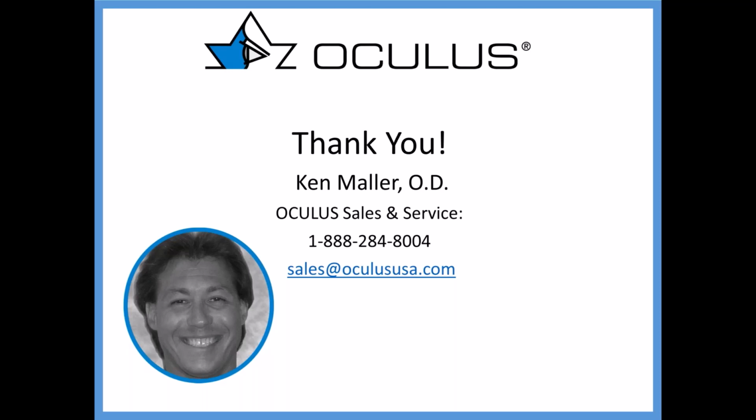For corneal densitometry, what numbers or metric is being used? I'll go ahead and answer that one. A set amount of light is being shown by the Pentacam, and based on the contrast in the different images, the Pentacam is able to determine how much light is being reflected off the cornea, and what percentage of that light is being reflected gives those numbers. But if you have the Pentacam in a non-totally dark room, those values can be affected because there'll be more light in the room.